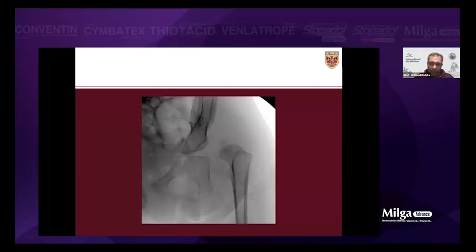Perfect. Now I've tried the open reduction, I reduce the hip and I take a picture with X-ray. Some people do the capsulorrhaphy now and then do the DEGA after. I prefer to do the DEGA first and then the capsulorrhaphy. For a deficient posterior acetabulum, I would leave it to the next case. This is a pure DDH and the deficiency is anterolateral, but I have a case with posterior deficiency I will show you right now, if you guys are still awake.